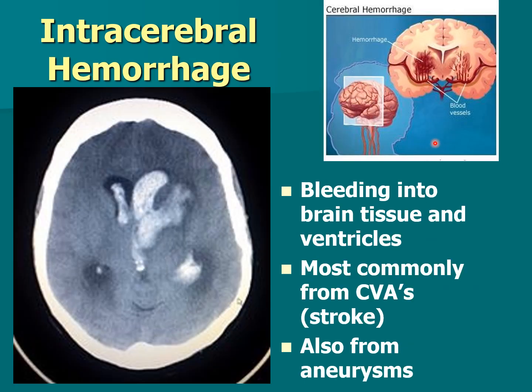And then we have the intracranial hemorrhage, where it's bleeding here in the middle of the brain. Most often, this is from a hemorrhagic stroke, a hemorrhagic cerebral vascular accident, where you get bleeding out into the brain. And you can see now it's out into the ventricles, it's out into the posterior horn of this lateral ventricle, it's in this lateral ventricle here, and it's just out in the tissue. So most commonly from CVAs, or commonly called a stroke.